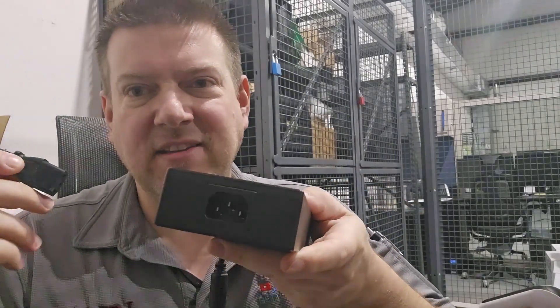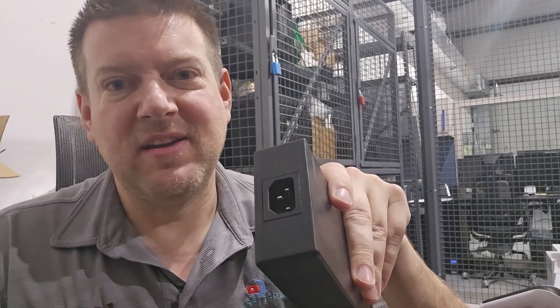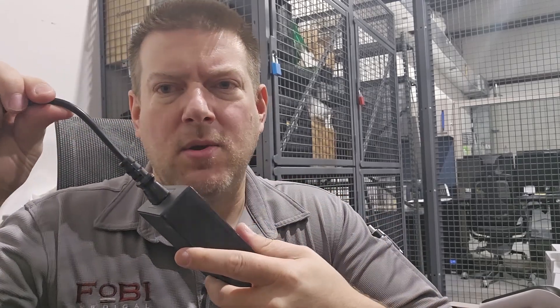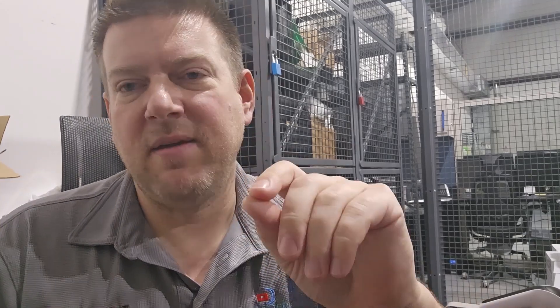This right here is an IEC power input module, and this one's in beautiful condition. However, I want you to take notice how easy that cord pulls out. This happens all the time on medical equipment where the cord is falling out or rocks really heavily in the IEC port.